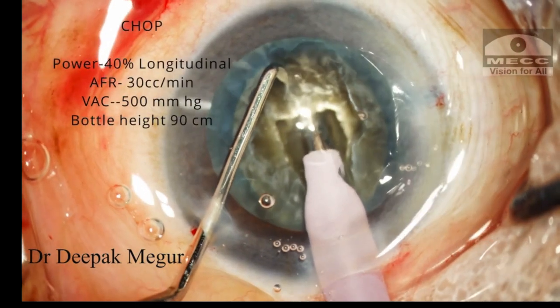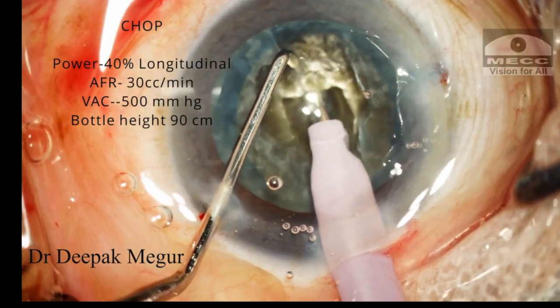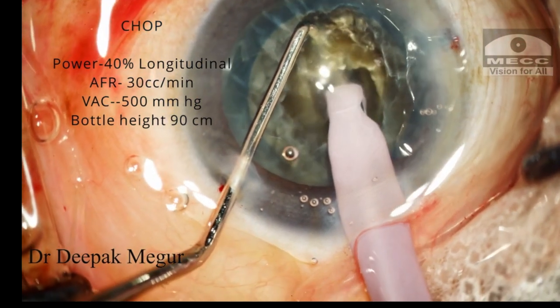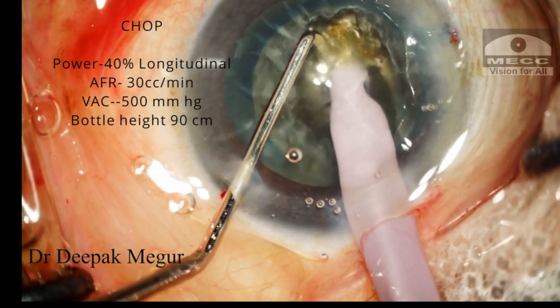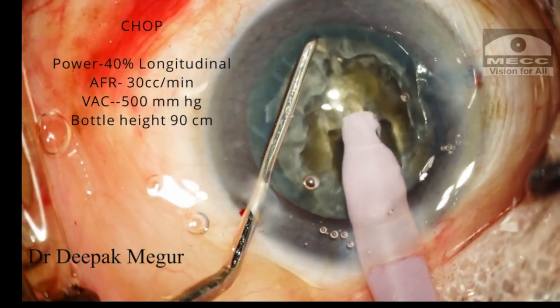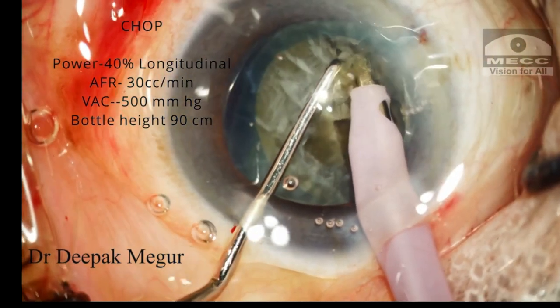Now I switch to my phaco chop settings. I'm just using longitudinal power in burst mode. I'm burying the tip into the nucleus until the entire tip is submerged into the substance of the nucleus. Then the sharp chopper moves down vertically and then laterally.